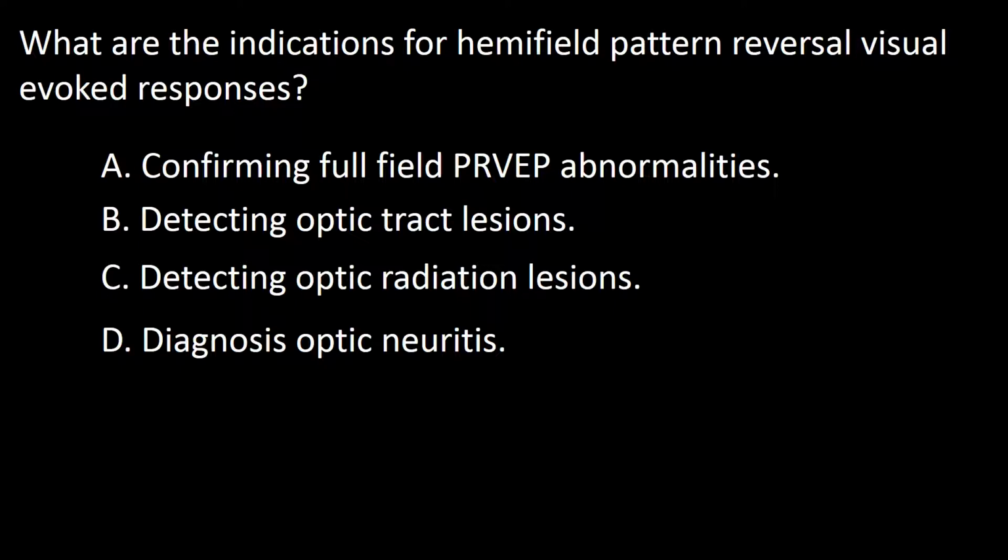The first question is, what are the indications for Hemifield pattern reversal visual evoked responses? A. Confirming full field pattern reversal visual evoked potential abnormalities. B. Detecting optic tract lesions. C. Detecting optic radiation lesions. D. Diagnosis of optic neuritis.